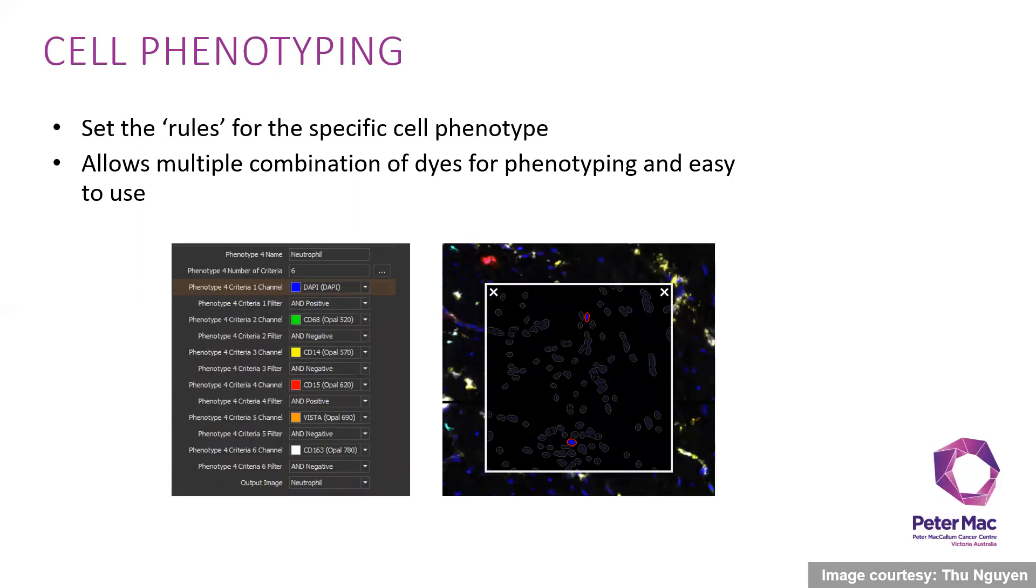For example, this particular phenotyping is using six different criteria from a seven-plex panel. It's using neutrophil for phenotyping of neutrophil and has six different rules here. The right image shows the preview of what it looks like from the cell population here.